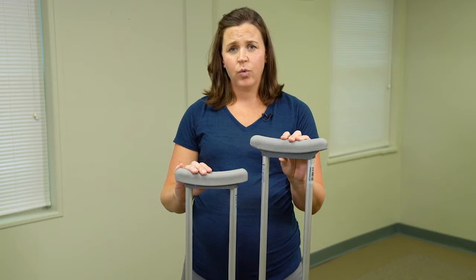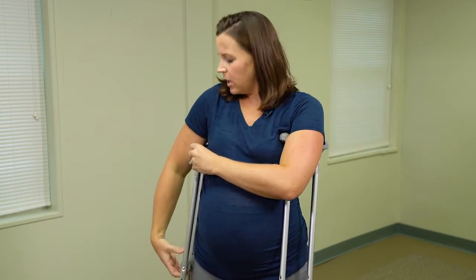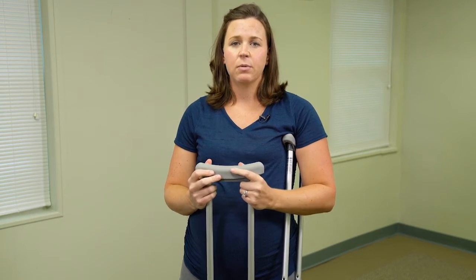Crutches should not hurt when you're using them. Be sure that you are not leaning on the crutch with your armpit and that you're using your arm and the side of your body to keep the crutch in place. If it's still hurting, try readjusting the crutch to a different height with the tips that we showed you, or follow up with your healthcare provider.